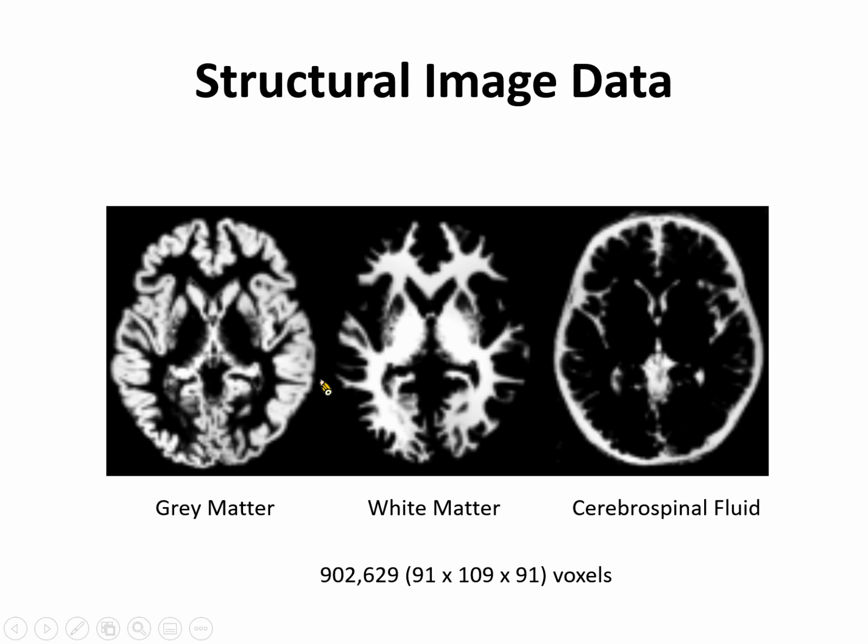The data we use will be from the gray matter areas. From these data, we can derive the brain volumes from certain brain regions.